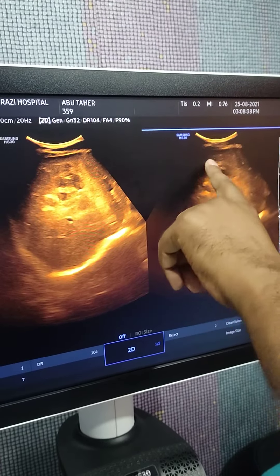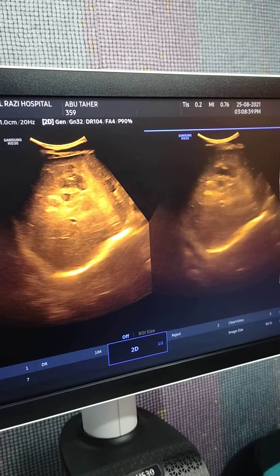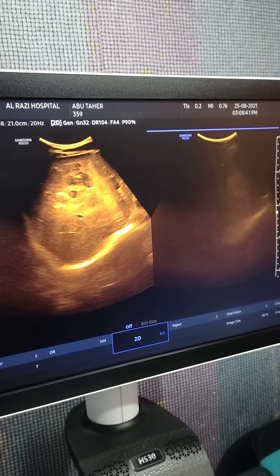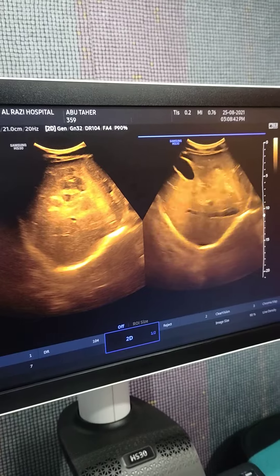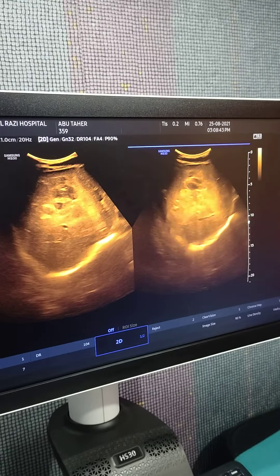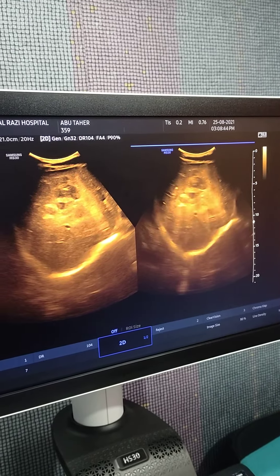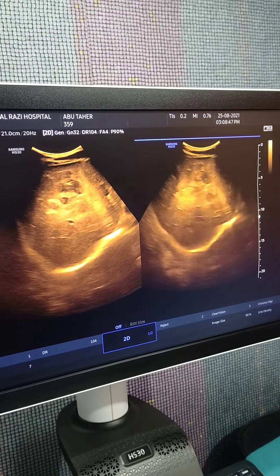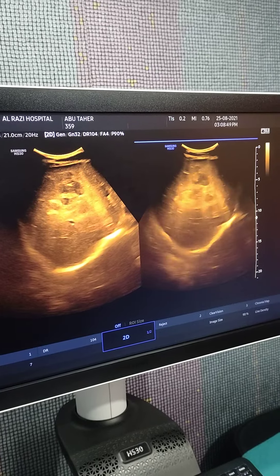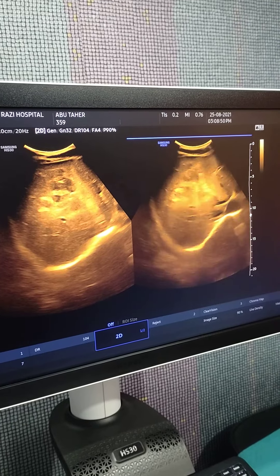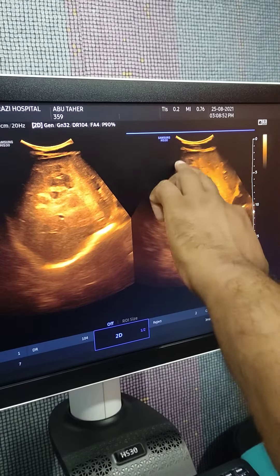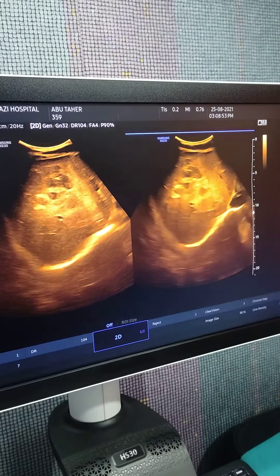Cysts with daughter cysts and echogenic material. This is a case of hydatid cyst in the liver.